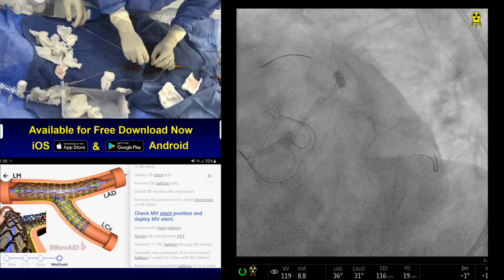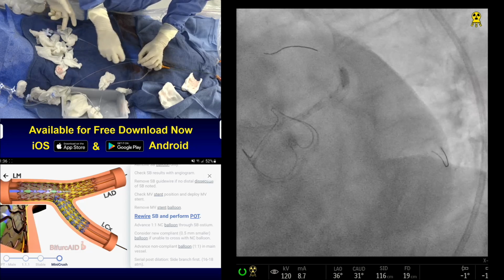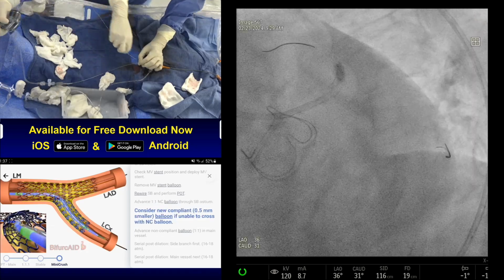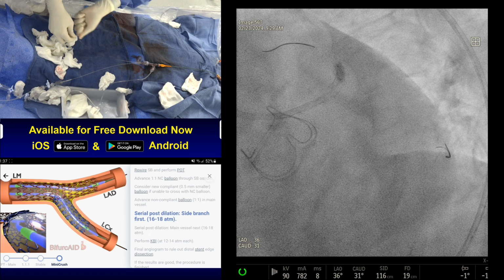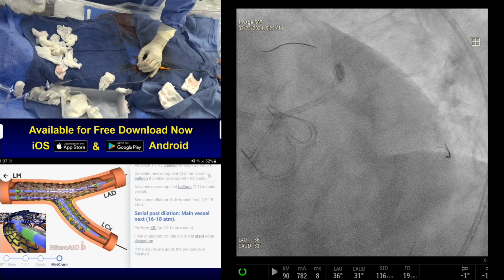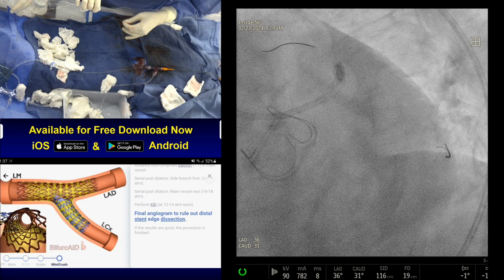I think your 2 balloon is pretty long. You have to take a smaller one. Yeah, this is the 2.0 by 12, right? Or 15? We have an 8. Or 1.5. Do you want 1.5? No, 8 millimeter is what you have. 1.5 is better because of the angulation, I think a smaller balloon is better. Angle is very bad. What is that? 8 millimeter, right? Oh, Sprinter Legend. Mini Trek.